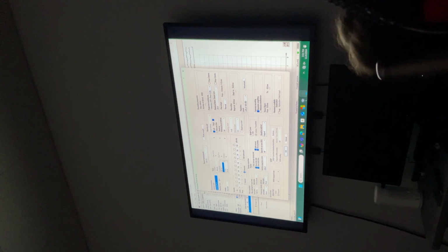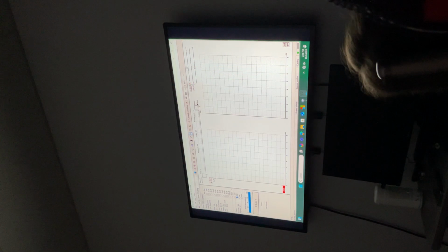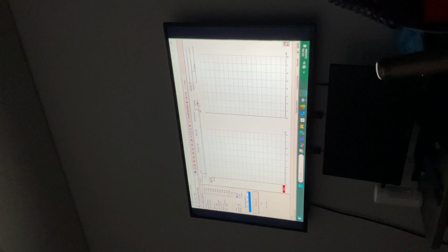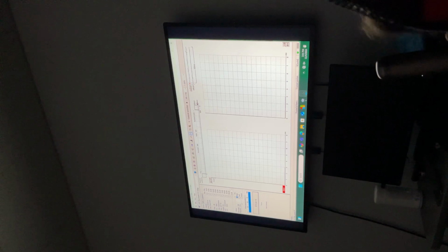Okay, so which EEG is good. This is right. This is left. Left is a little better, right? Or the same? The same. This is the same. Okay. So we'll start at 70 dB. So this is broadband chirp, right here, insert, 31.1 stimulus per second. Alternating polarity, 33 to 1500 Hz. That's the band pass filter. Start.